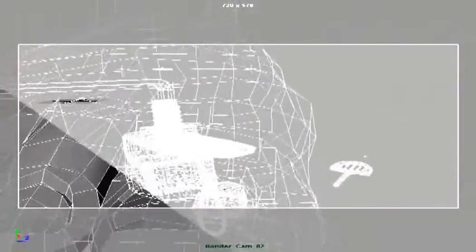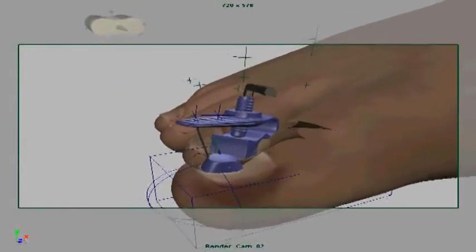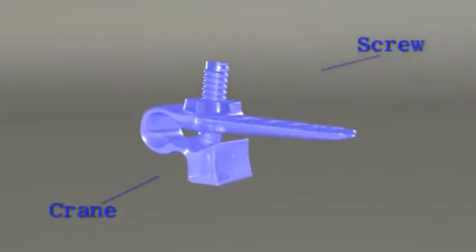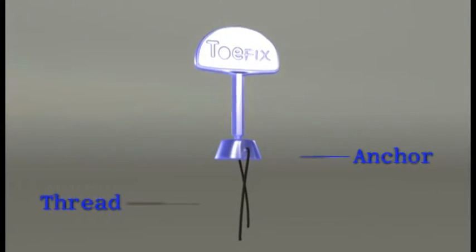Now you are about to watch a simulation of the patent. The parts of ToeFix are crane and screw, anchor and thread.